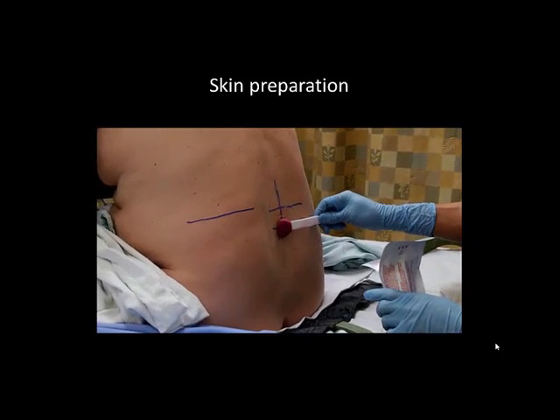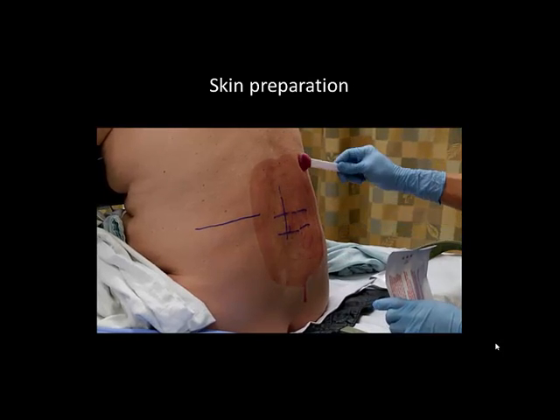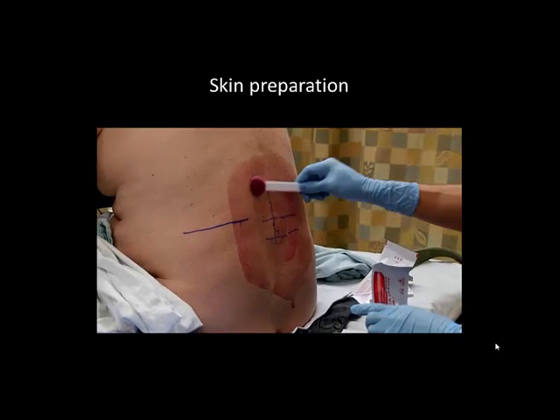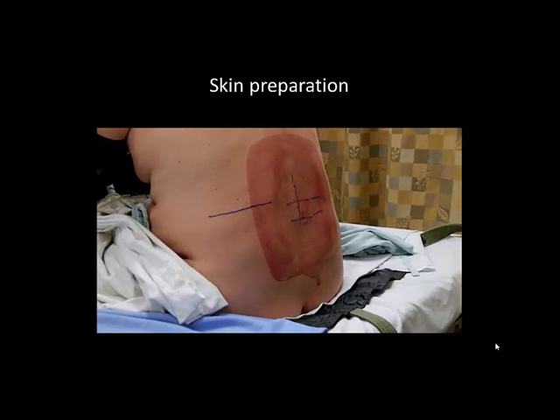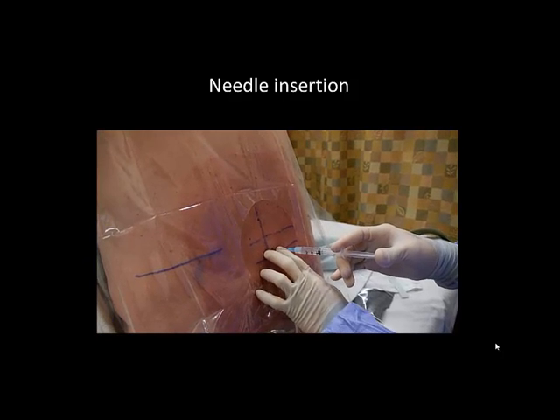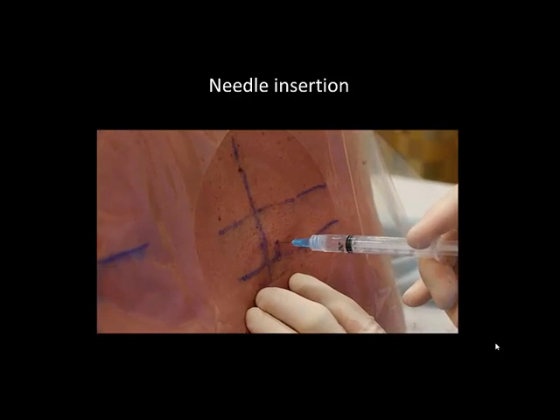If the skin markings were made on dry, clean skin, they can be preserved by careful skin preparation. If desired, the needle insertion point can also be further marked by indenting the skin with the hub or cap of a needle. Local anesthetic is infiltrated at the marked insertion point. Unlike a midline approach, the needle will be passing through paraspinous muscle, which can be painful, and thus generous infiltration to the full length of the needle should be performed.